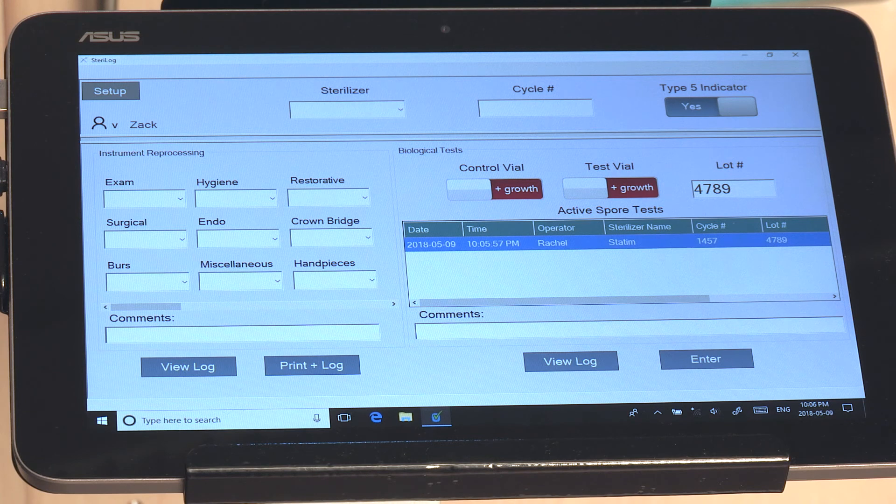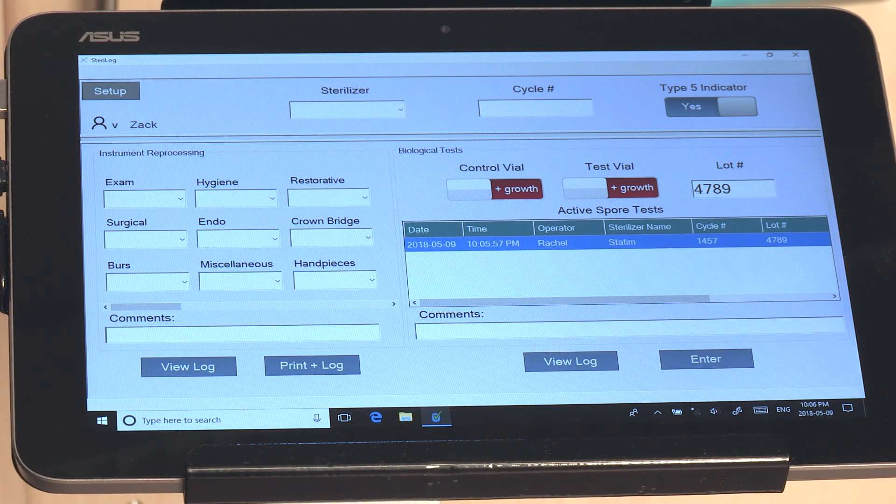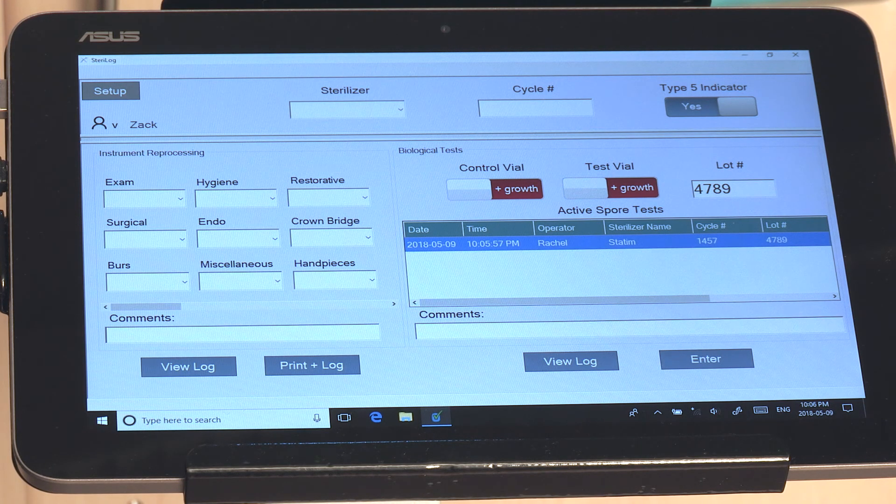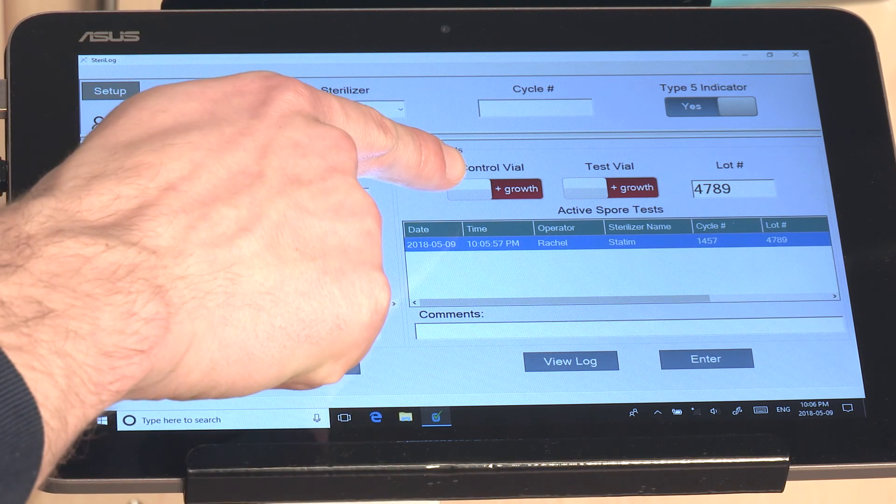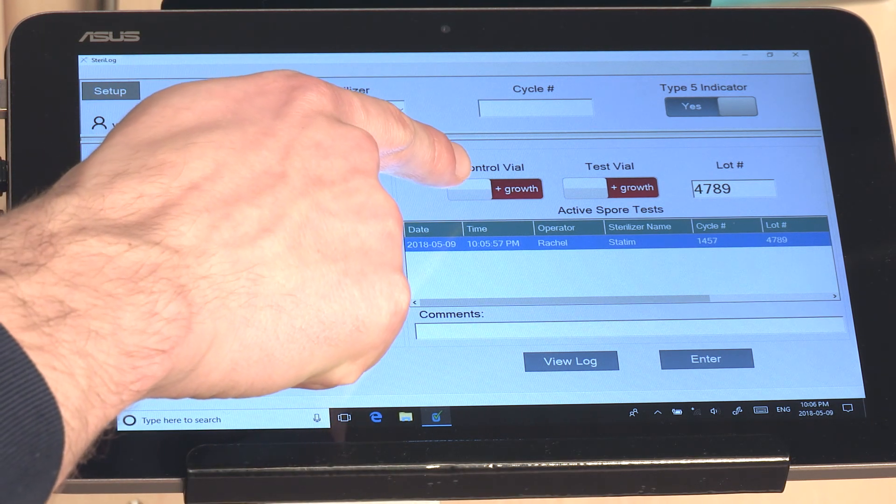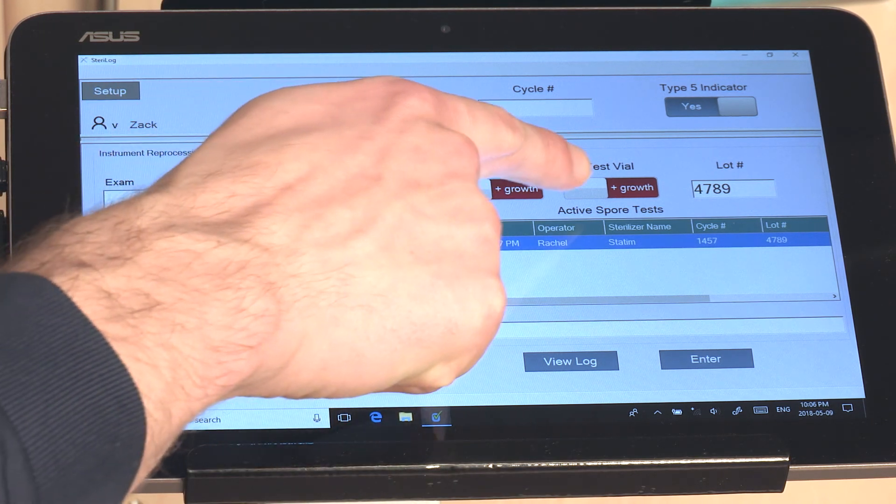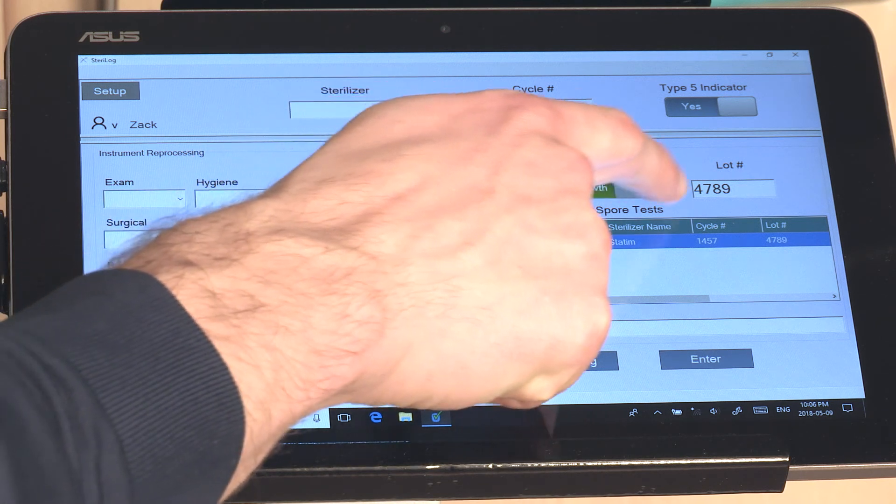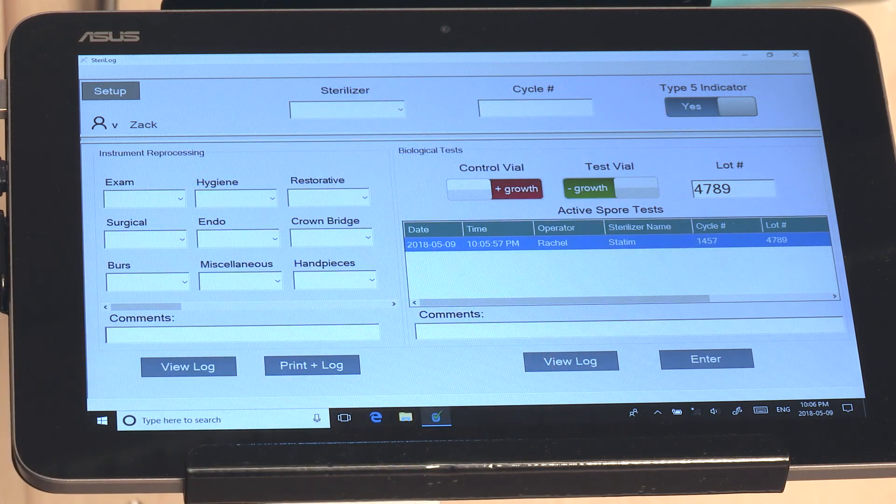If the biological indicators have passed, then the control vial should have positive growth and the test vial should have negative growth.